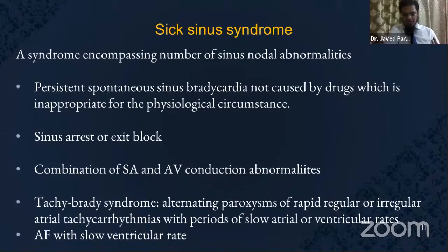The difficulty lies where the patient presents to us with syncope and we cannot demonstrate a significant sinus pause or sinus arrest, and we just have sinus bradycardia. In these patients, syncope is a common presentation of sick sinus syndrome, but the onus lies on the physician to prove that the syncope was clearly because of sinus arrest or pause. Just having sinus bradycardia on ECG and syncope doesn't put together 2+2=4 and doesn't give us conclusive evidence that sinus node dysfunction is the cause of syncope.